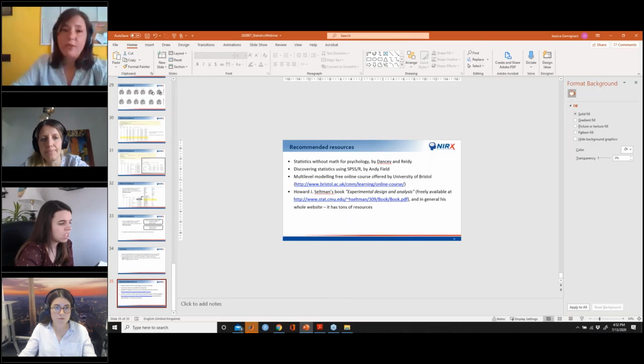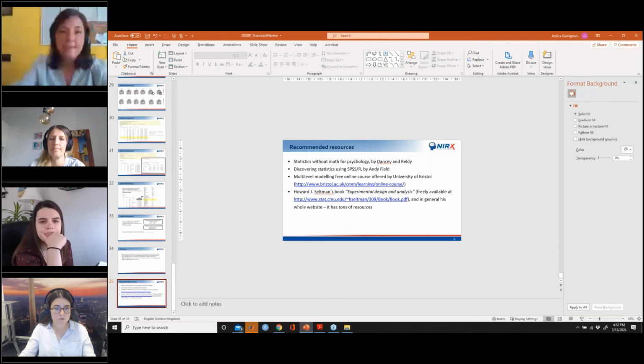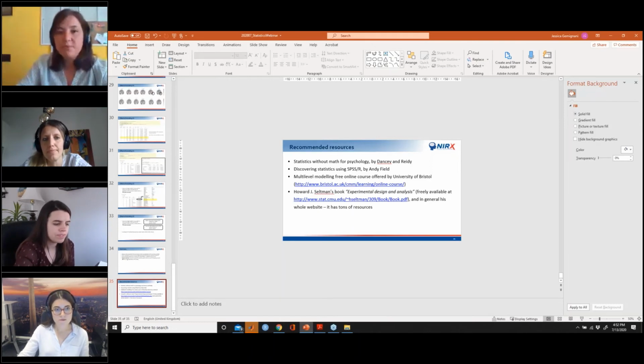Of course. If you're using a mixed effect model, or even a fixed effect model without a random effect, you get an estimate for any effect that you enter into the model. Just like you get an estimate for condition, you get an estimate for group, age, IQ, and any other covariate that you have. So yes, you get an F value and the degrees of freedom, and you report it that way in the paper, in the article.